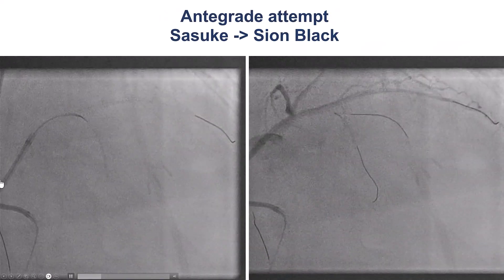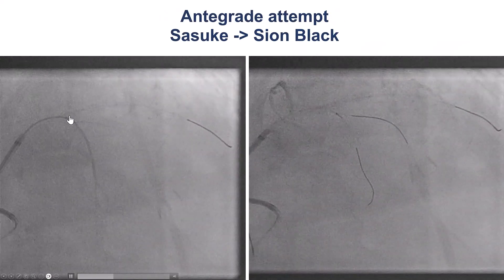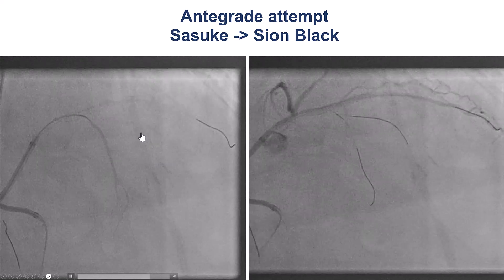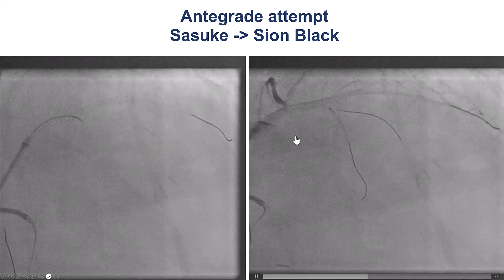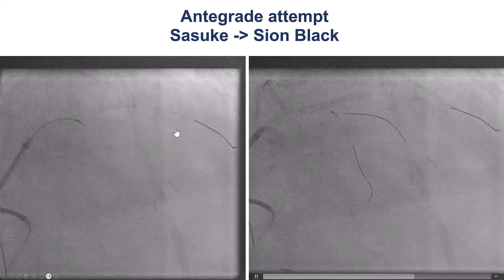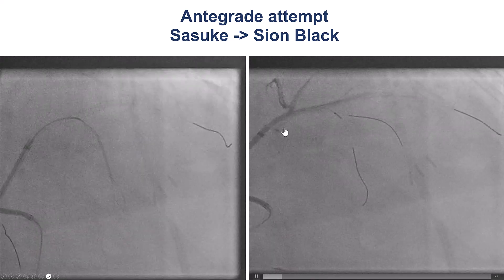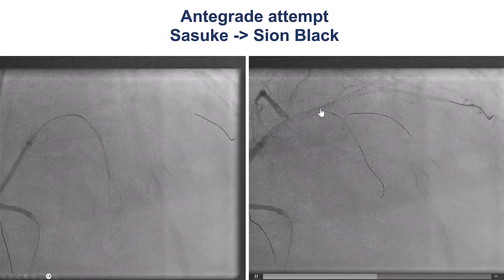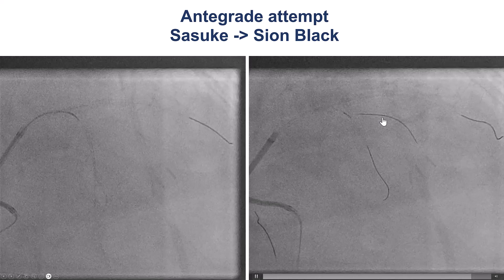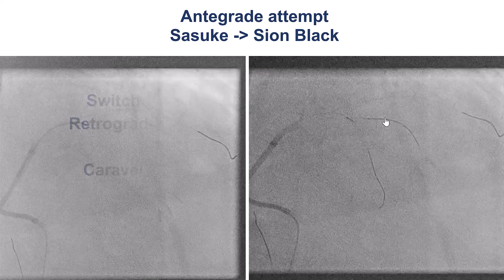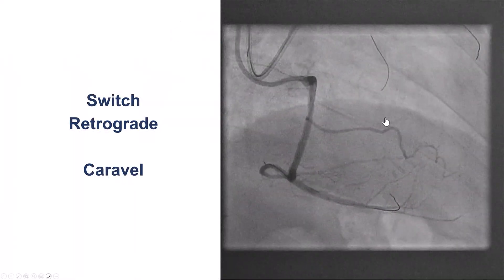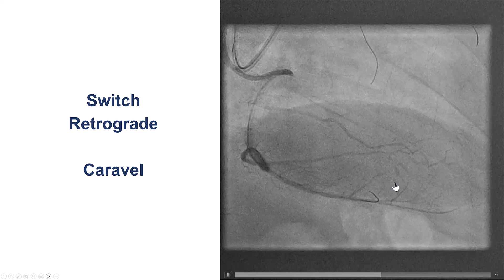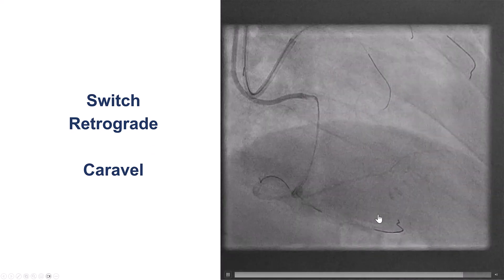When the patient came to the cath lab, we did some additional attempts to determine where the proximal cap is. We inserted a wire into these branches, tried to do intravascular ultrasound, and used a dual-lumen microcatheter, but clearly this was not connected. So we decided to switch to the retrograde approach.